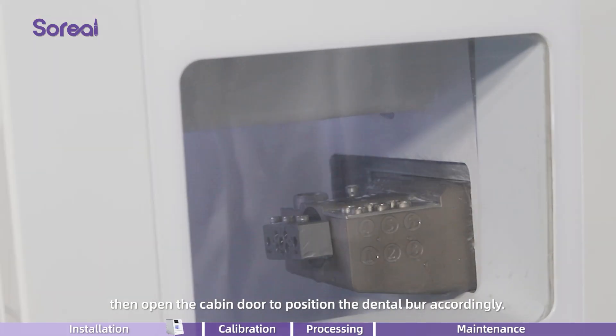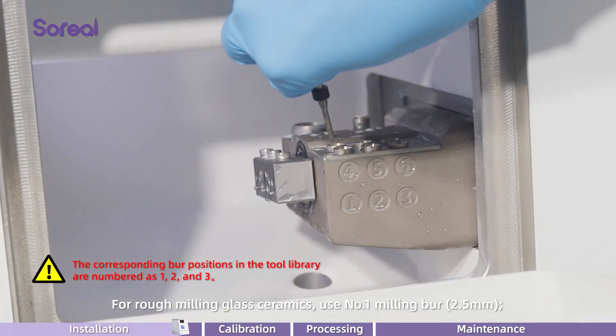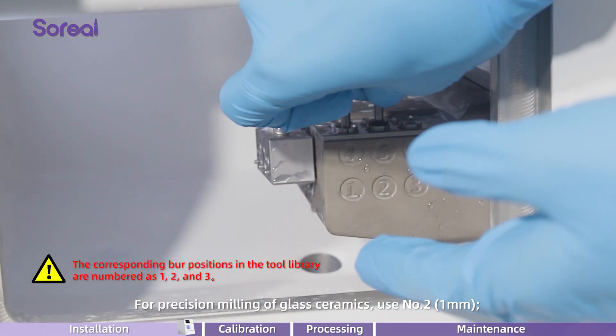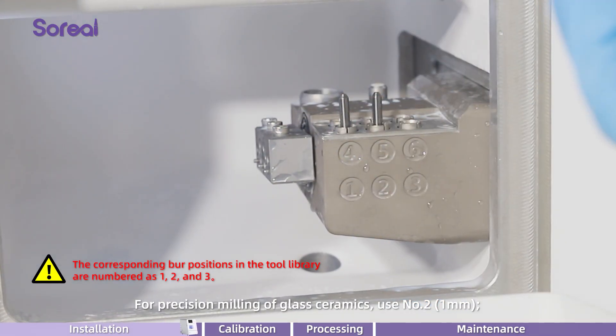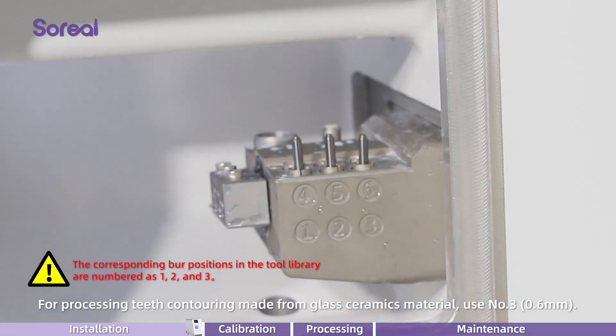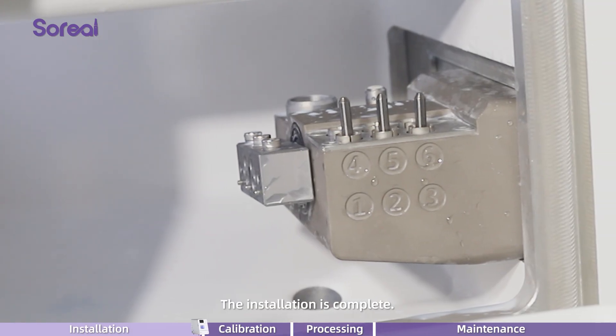Then open the cabin door to position the dental burr accordingly. For rough milling glass ceramics, use number 1 milling burr. For precision milling of glass ceramics, use number 2. For processing teeth contouring made from glass ceramics material, use number 3. The installation is complete.